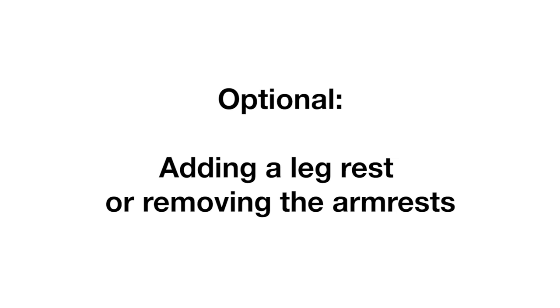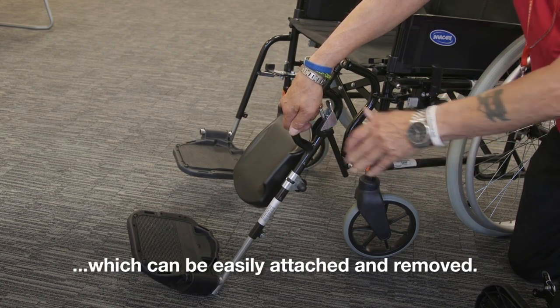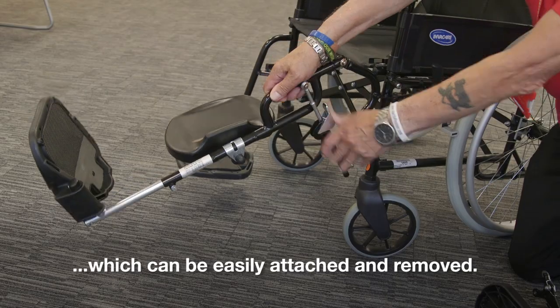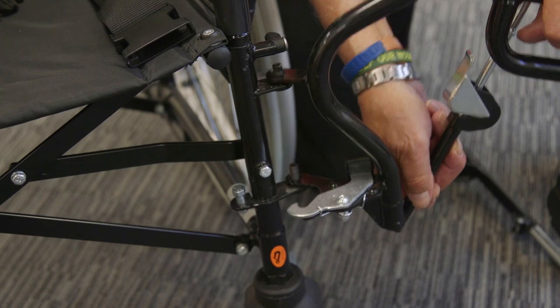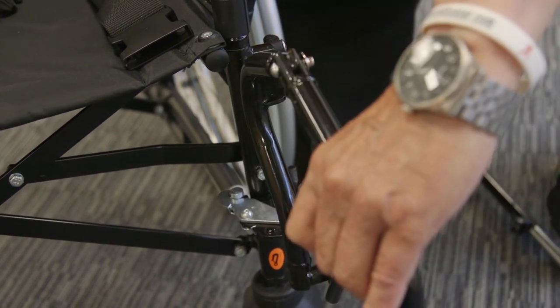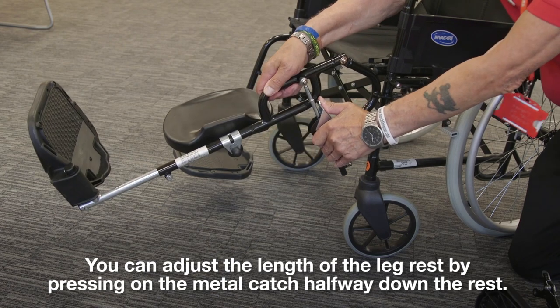Optional: Adding a leg rest or removing the arm rests. You may also have borrowed a leg rest with your wheelchair, which can easily be attached and removed. Remove the footplate and attach the leg rest in the same place. You can adjust the length of the leg rest by pressing on the metal catch halfway down the rest.